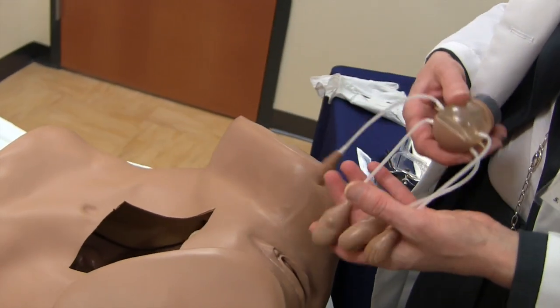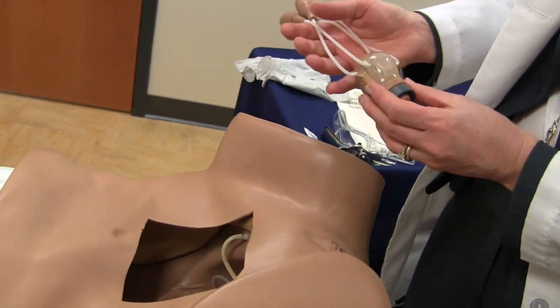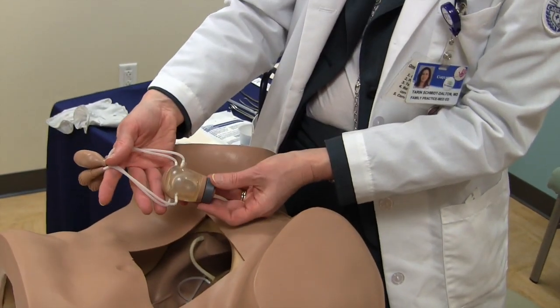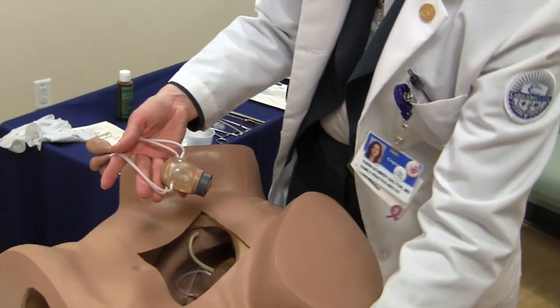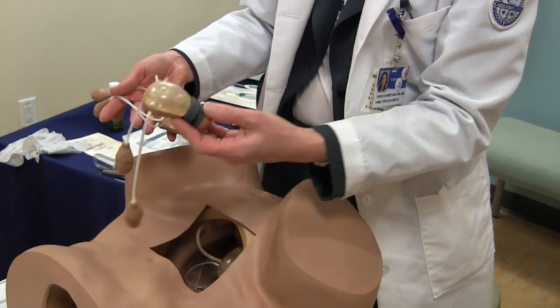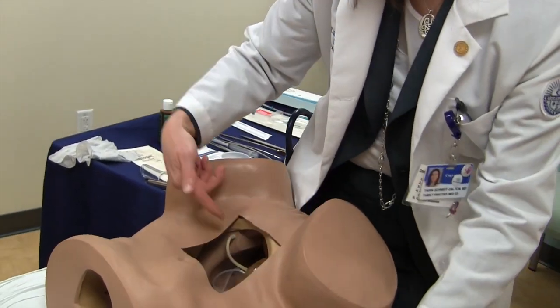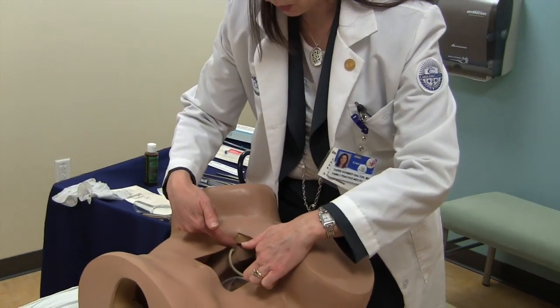With this one we have inserted a transparent uterus. Notice that the simulator comes with two types: one with an anteverted position and there's also one that has a retroverted position. They can be easily inserted within the model itself, suspended and protected.